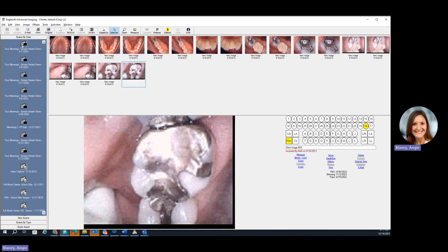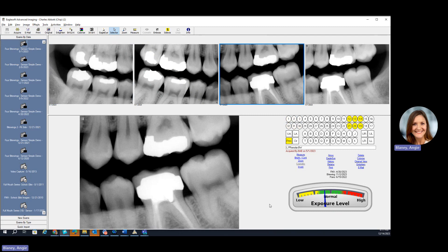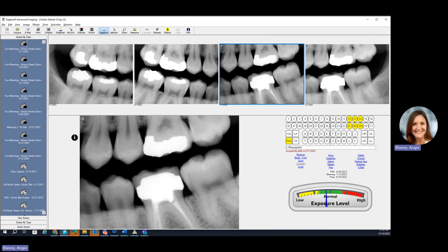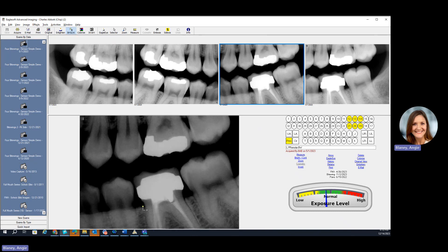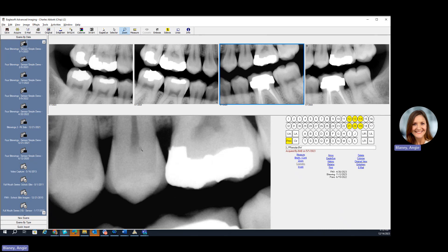There are a lot of different tools that you can utilize in EagleSoft, so it's a very robust full imaging suite. We have our exposure level indicator here, letting you know that you're within normal range of your KVP, your exposure level. There are also some tools at the top — we have an eagle eye, which is nice when you're trying to detect interproximal lesions. You can also increase or decrease the brightness, and there's a zoom option as well.